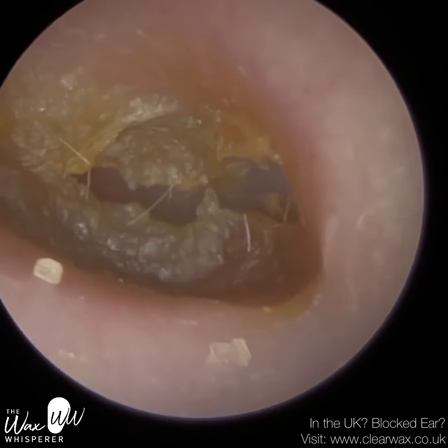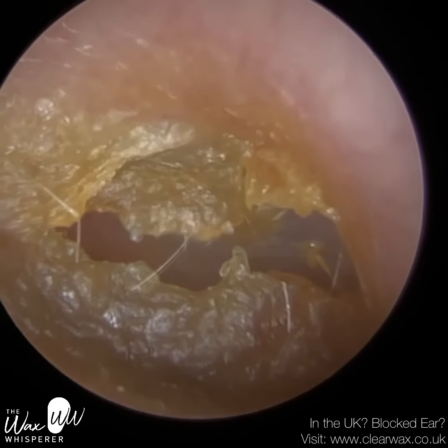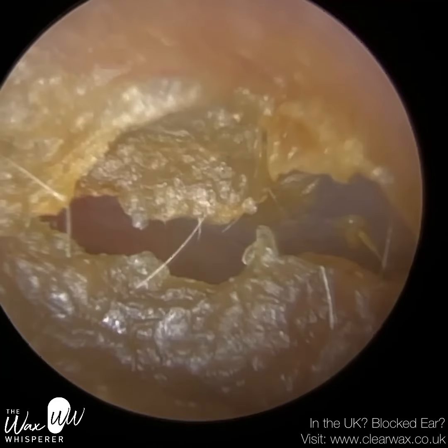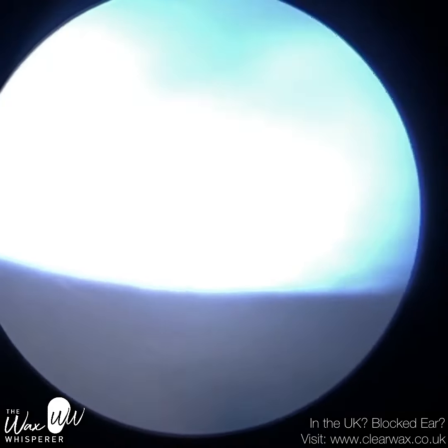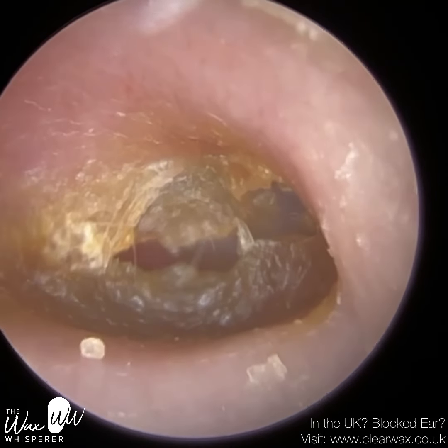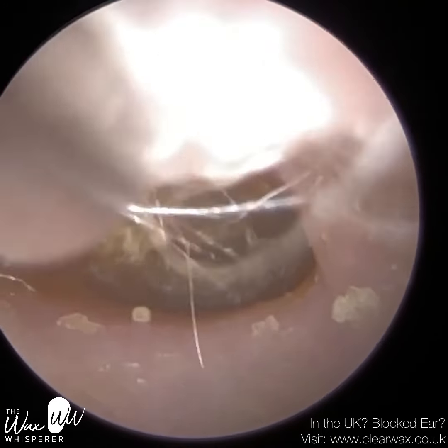Hi everyone, this is Mr Neil Reiter, also known as The Wax Whisperer. Thank you for joining me in my latest video. This is of a patient who attended with really thick, hard and encrusted dead skin — so what we call keratin — that was embedded on their eardrum.